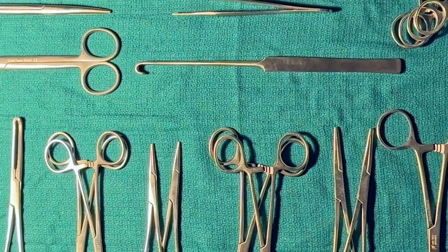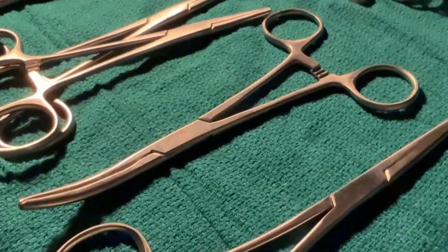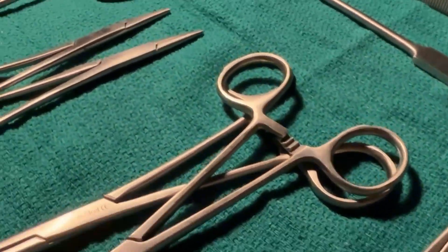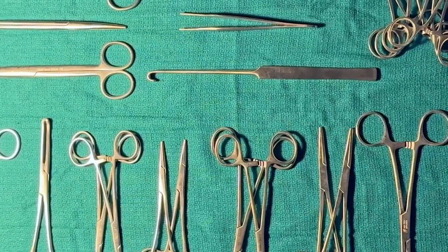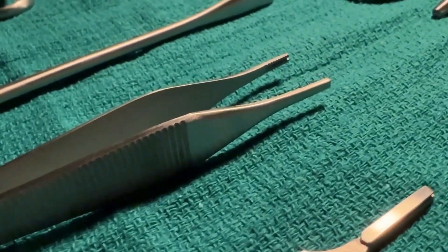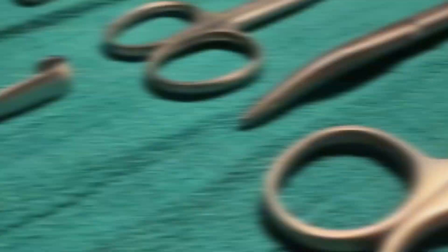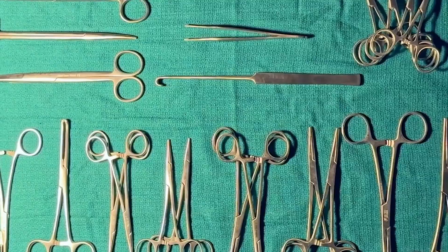Each of these surgical instruments embodies a legacy of meticulous craftsmanship and innovative design, all aimed at enhancing patient outcomes. Today, you'll embark on a journey to join the ranks of professionals who understand the intricate stories behind these expertly forged tools.